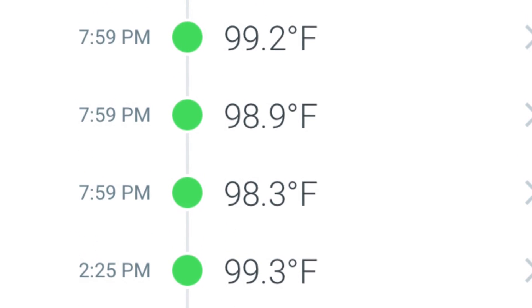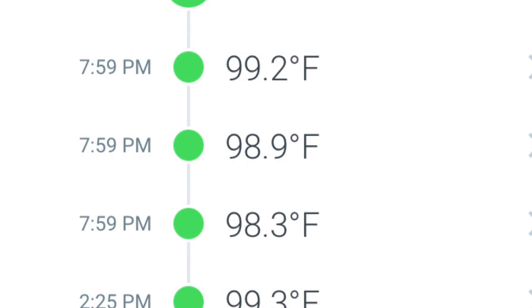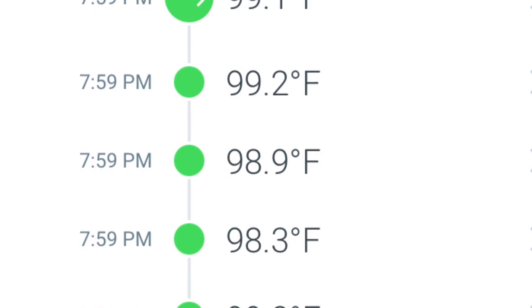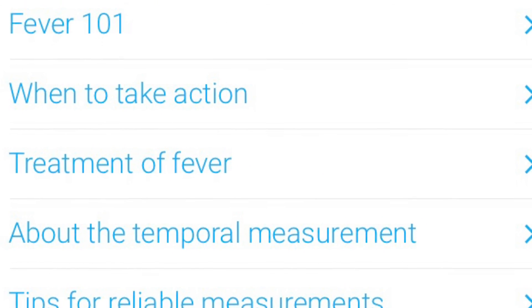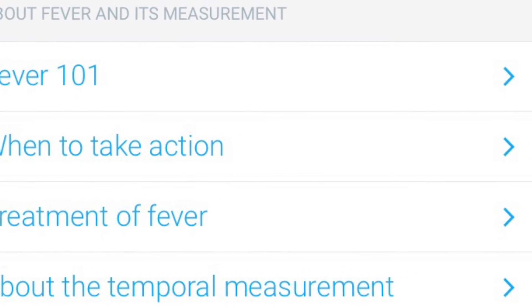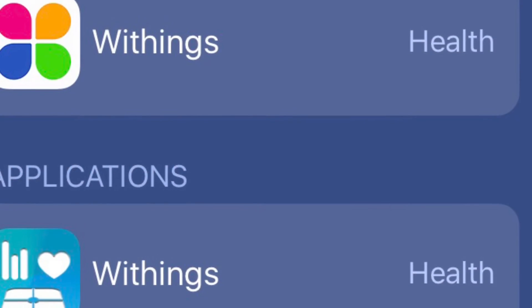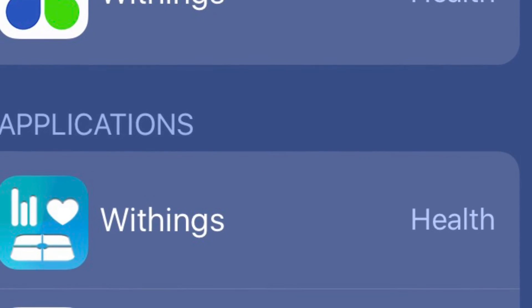It's 100 bucks. Here's what the temperature looks like in the Withings Thermo app. It's got some other functions in there too — it gives you advice if you have a fever, like when and how to take action. I'm a little annoyed that it doesn't work with Withings' other apps. I looked into the more generic Withings app and it wasn't in there.